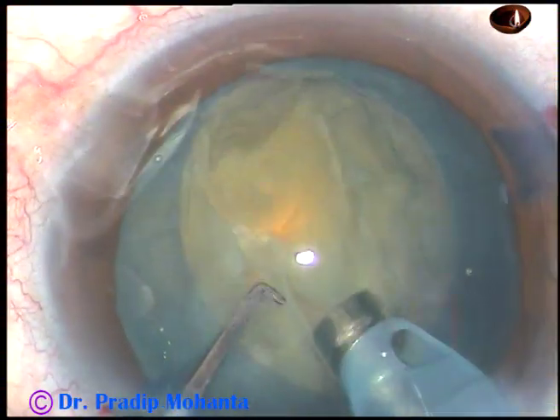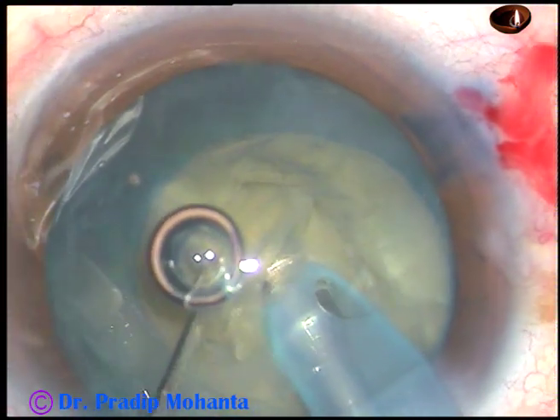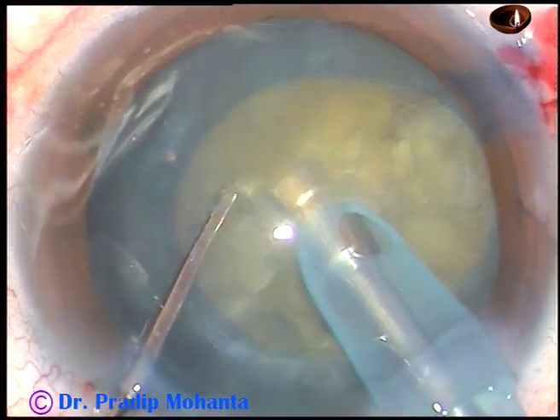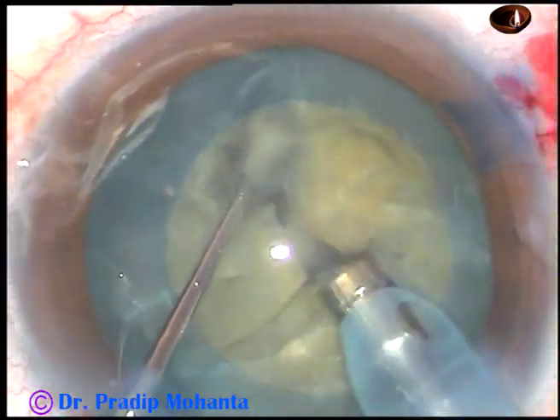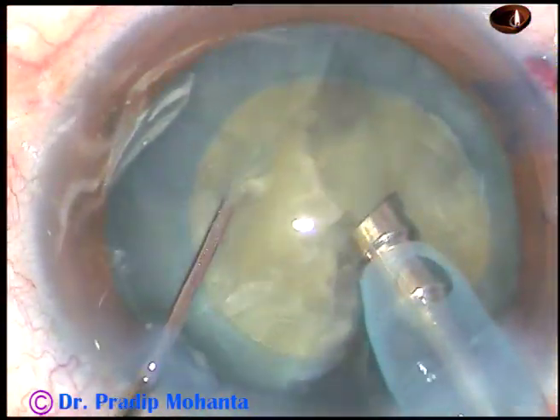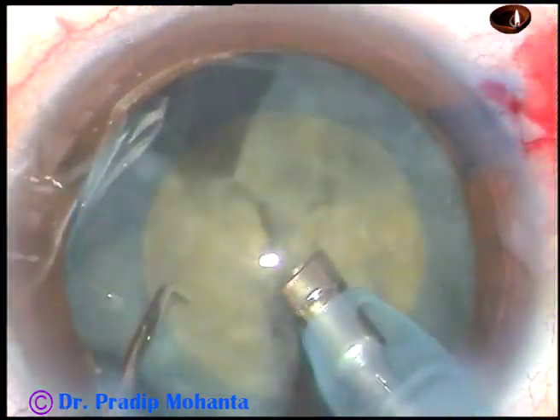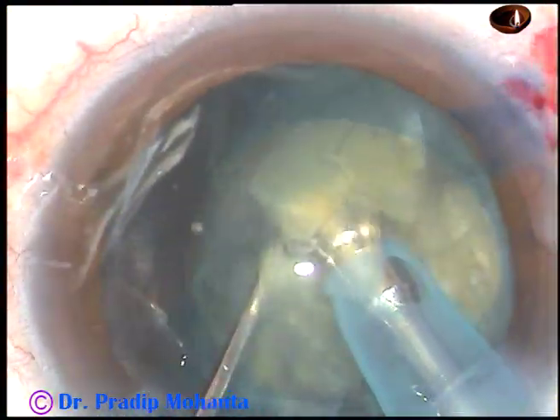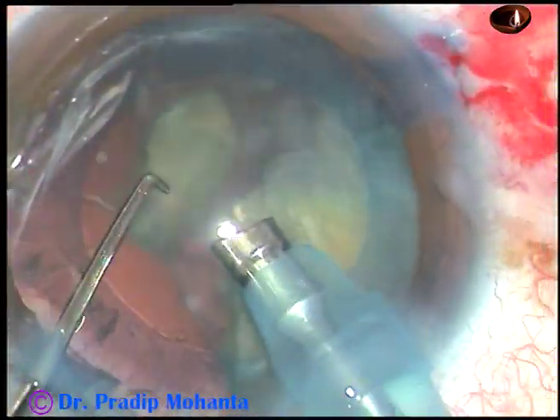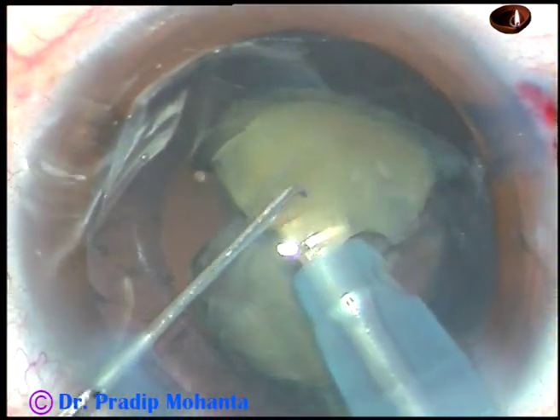Some superficial cortical lens matter is removed and now this is direct chop. The nucleus is not very hard in this case and the nucleus is brittle, so the nucleus is getting divided into fragments very easily. Beginners can choose this kind of case so that they can chop the nucleus easily into fragments. The phaco power used is 60 percent, flow rate is 45 ml per minute, and vacuum is 450 millimeter of mercury.